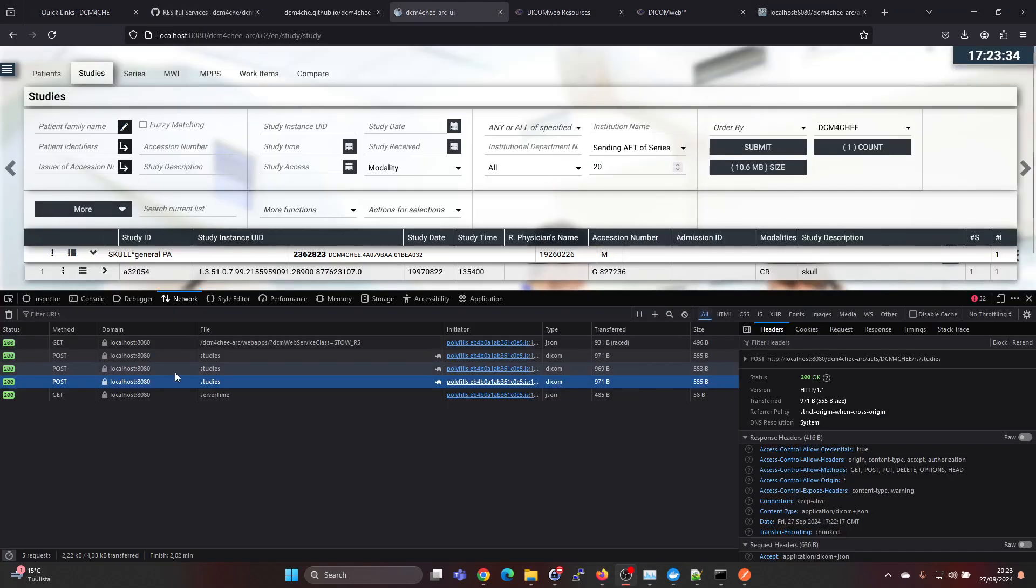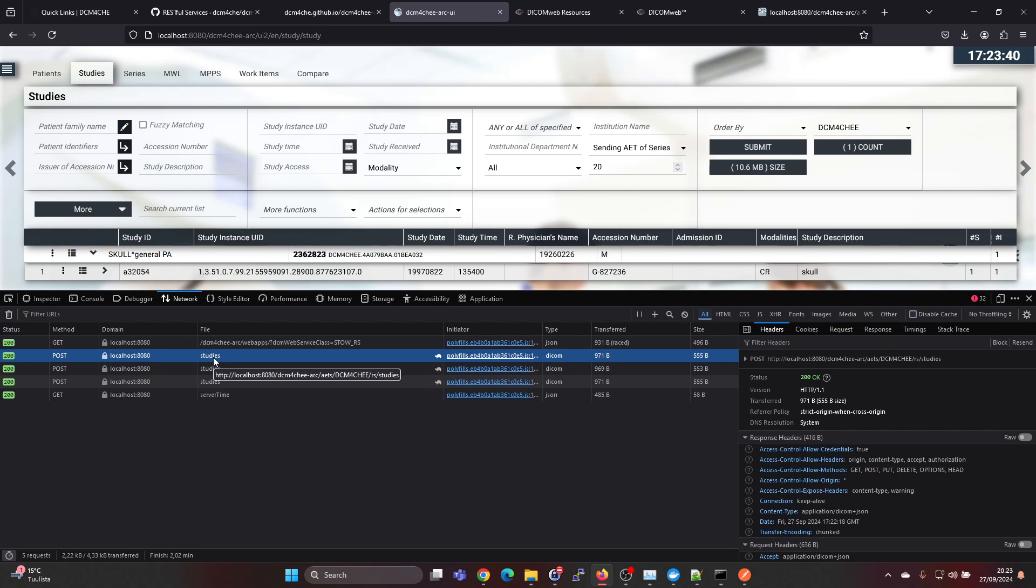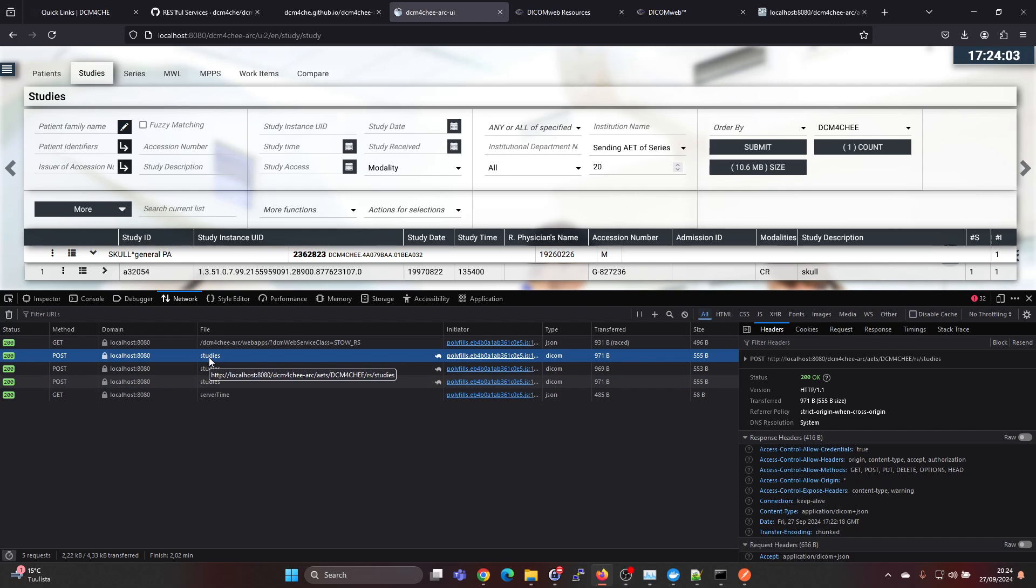What we would expect to see instead of a GET we should see a POST and again slash studies. If we check here we see POST, POST, POST, so we see three POST transactions here. If we hover over here we can see Dicom4ChE slash RS slash studies. It's using the StowRS to send and it's type DICOM.